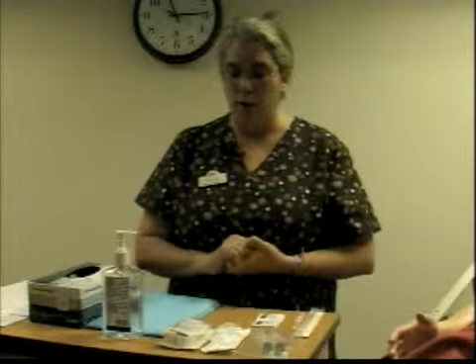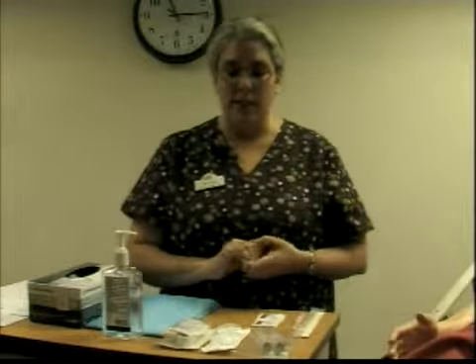Another thing that you have to pay attention to is the ability of the client to tolerate the procedure. A client that is confused or combative is going to fight you, of course, all the way through. So you want to make sure that you foresee any issues and bring help with you, not to restrain the client, but just to keep him busy while you perform the skill. So you are able to minimize the risk of needle stick for you and whoever is helping you.